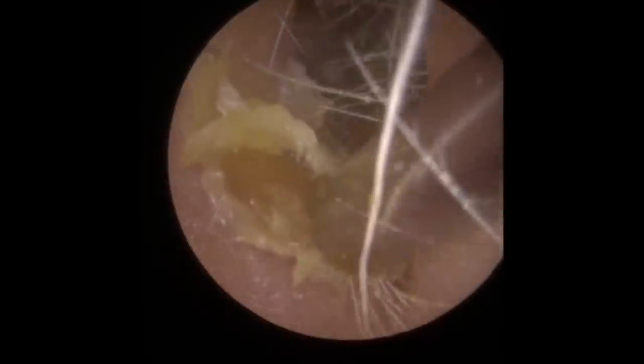Still more debris in here — still lots of little crumbly bits of earwax — so still using the Jobson horn bringing those forwards. A little bit just broke away, taken out of the bowl of the ear canal. Now we are starting to see the eardrum. We can see we have got wax against the right-hand canal wall, so we are just going to turn the Jobson down and work on that area. Always being very mindful that too much pressure can be quite uncomfortable for the patient — you do not want to go too crazy really digging in there with the Jobson horn. It can be really tender for the patient; it feels like a pinching or scratching sensation.